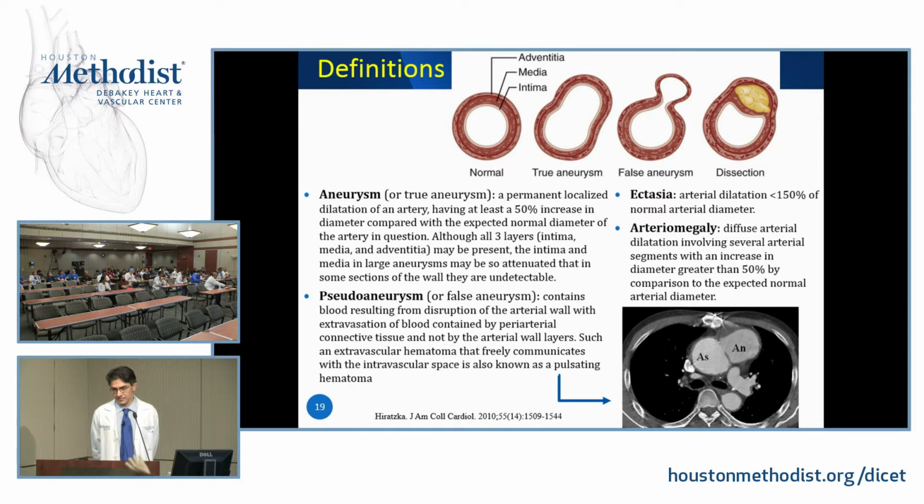I think there's also a geometric component, because hypertensive patients, for example, frequently have a diffusely dilated ascending aorta. It's all 4.1, 4.2. There's no geometric change. It's really a parallel increase in the aorta. Once you get into aneurysmal dilations, even dating back to when Dr. DeBakey defined many of them, you usually had, at some segments of the aorta, a geometric distortion where you had the actual dilation coming down, coming up.